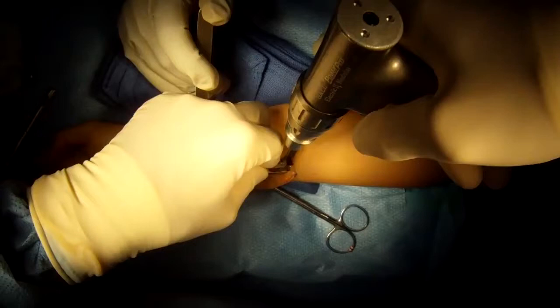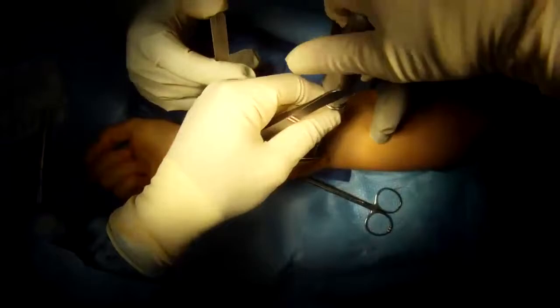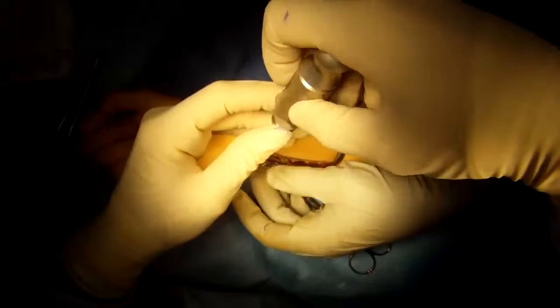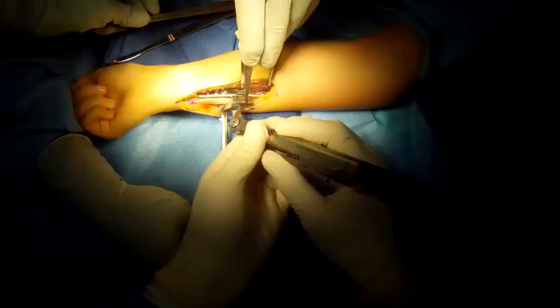Osteotomy means to cut a bone. We're going to cut the bone in two places and take out a few millimeters, then approximate the bony edges together to shorten it. This screw is being placed into a slotted hole so it can be loosened and retightened after the bone is shortened.